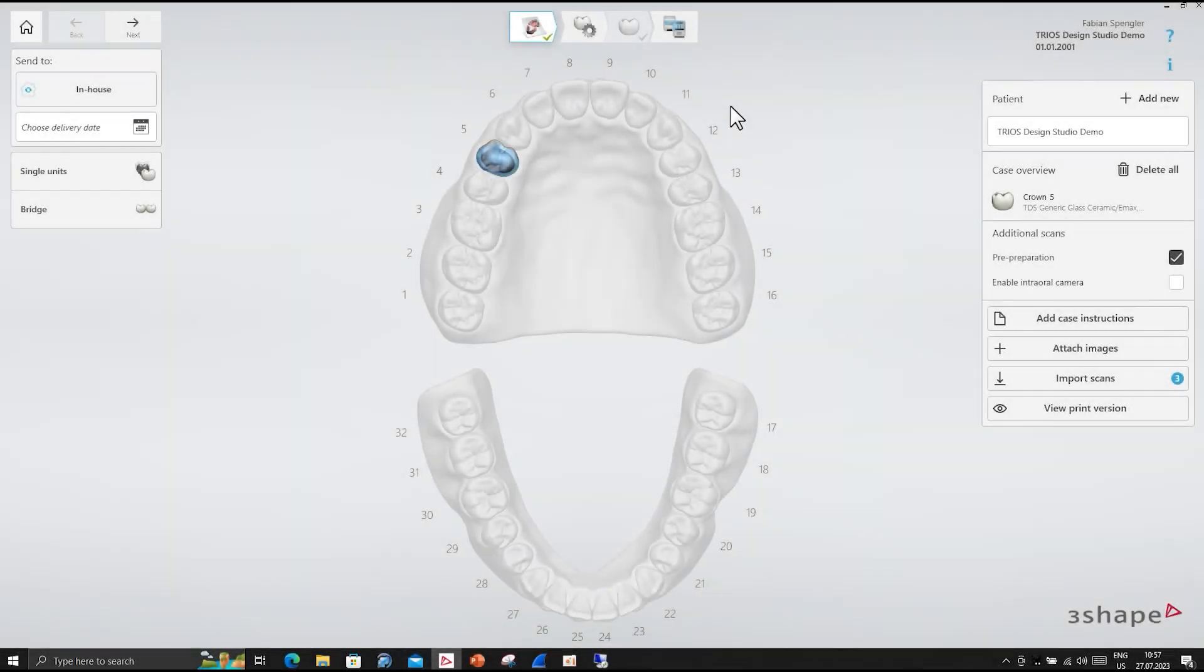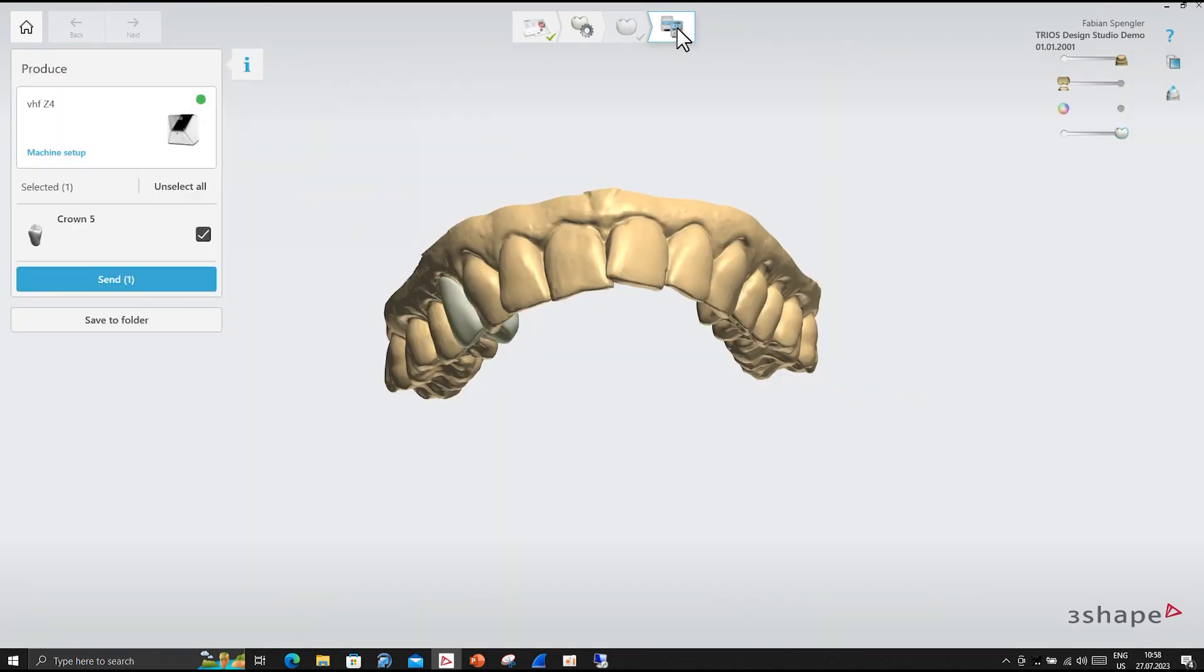Now setup is complete. To send your finished object from TRIO's design studio to your Z4, select send.